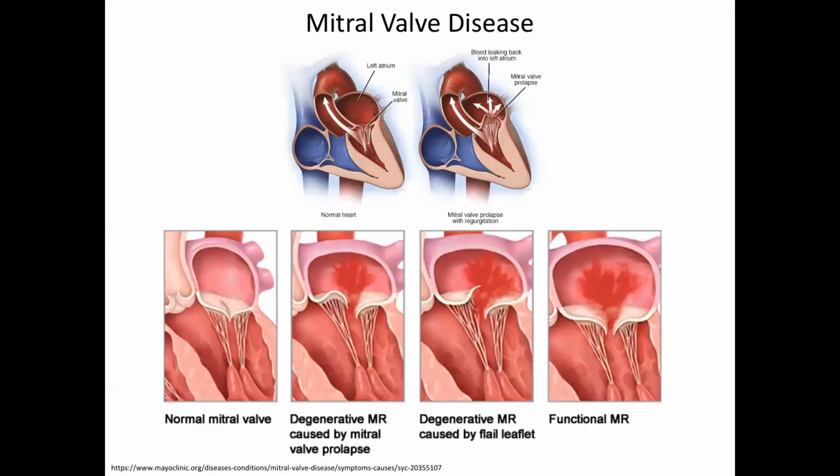So we'll start off where we left off last Tuesday, or 2 days ago, where we were looking at echocardiography applications, or ultrasound in the heart. And this is a slide describing the general classifications of mitral valve disease. This is a very common condition that people get as they age.